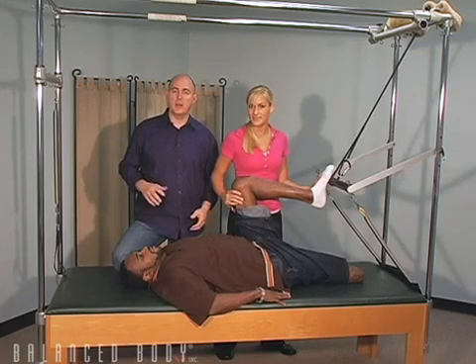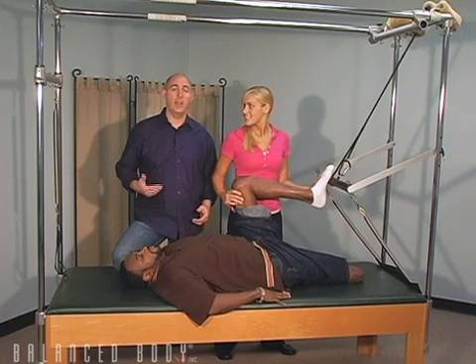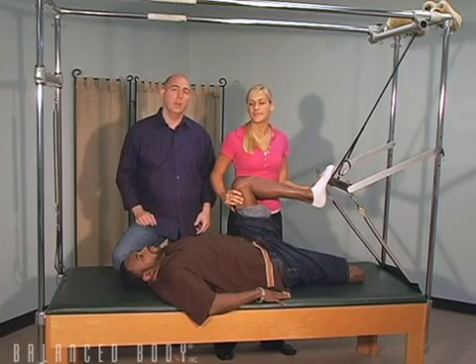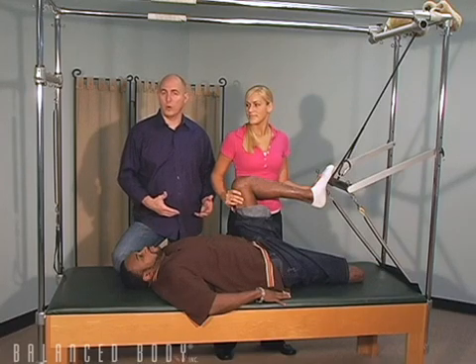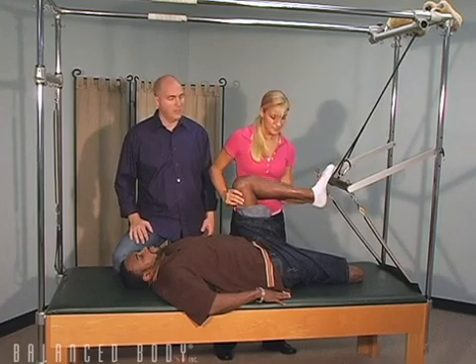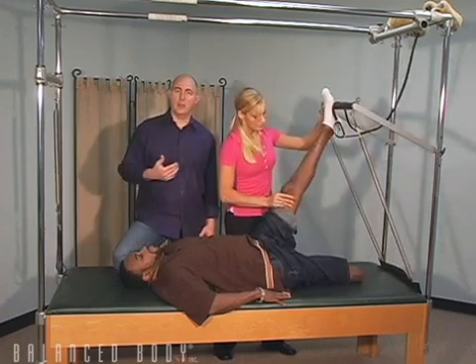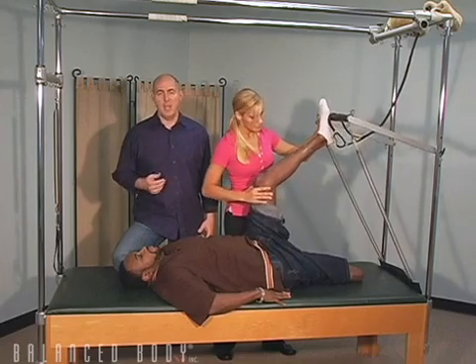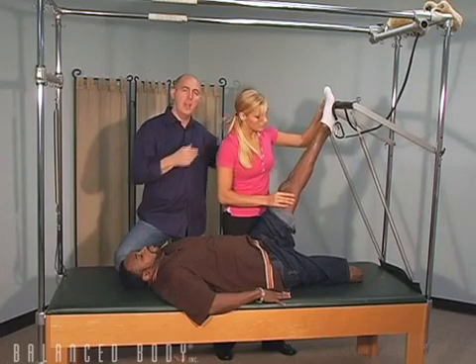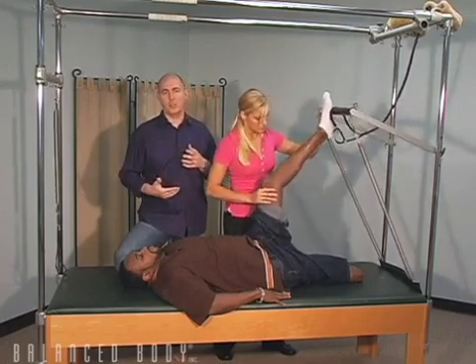And one of the nice things about the Pilates equipment is it allows us the ability to isolate movement where we can move from. For example, with Sean's residual limb, his left leg, we're able to work with him through a range of motion. So I've asked Wendy to help take him through some of his exercises. And go ahead and press up. And we can use the springs to basically be able to assist the flexion. And the arc of the tower bar itself moves through space and provides us with a very safe arc of movement that Sean can participate in.